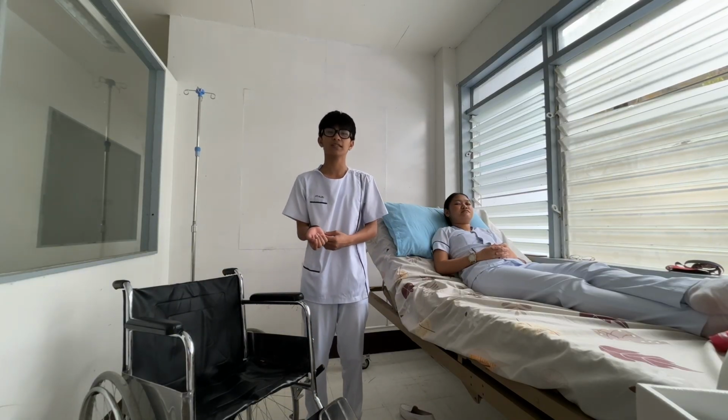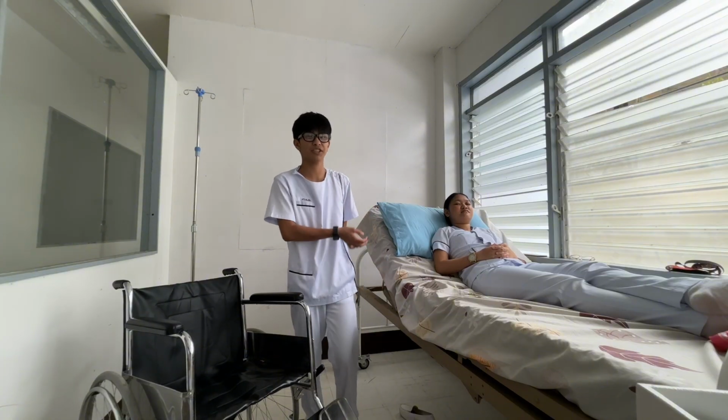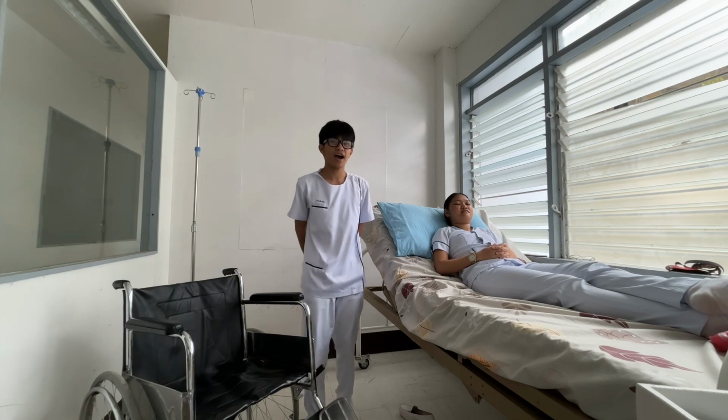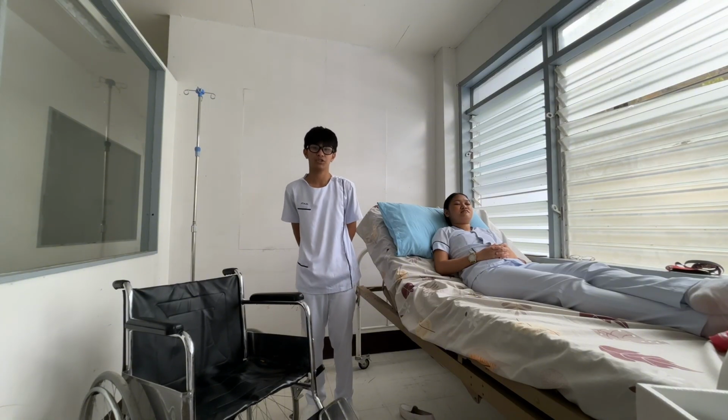Then, assist the patient to a sitting position as prescribed in assisting a client to a sitting position. Once the patient is seated at the side of the bed, stand in front of the patient and assess for ability to balance and complaints of dizziness. Allow legs to dangle a few minutes before continuing.